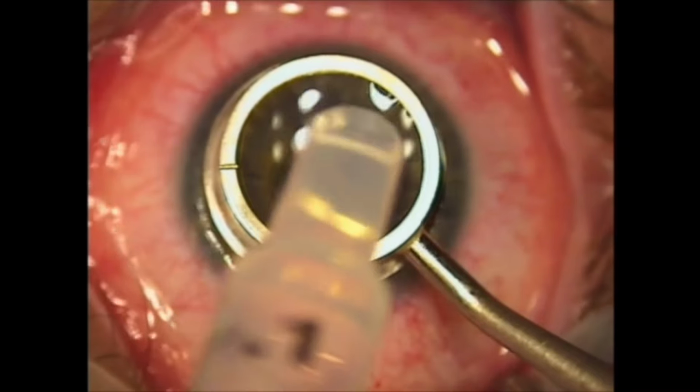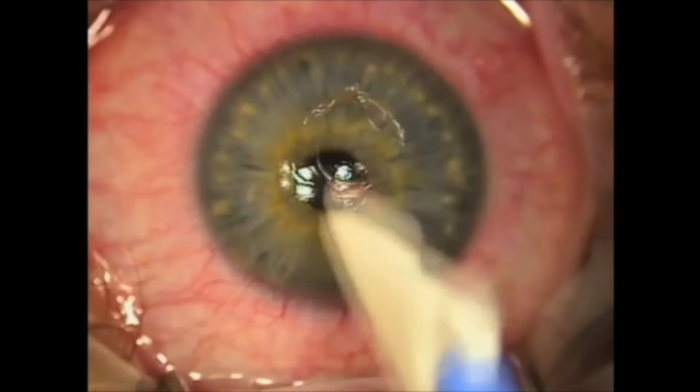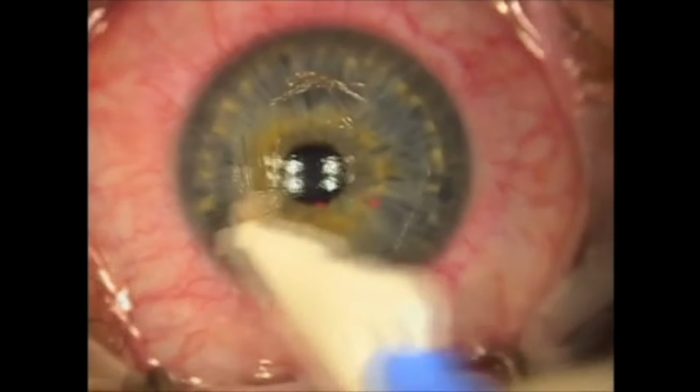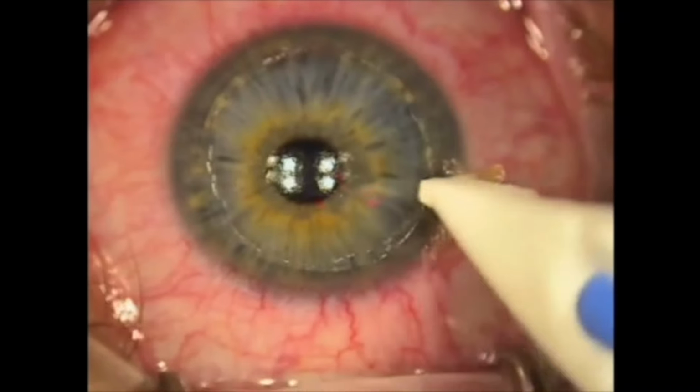This is Dr. George Waring from Charleston, South Carolina, and I'll be discussing photorefractive keratectomy, or PRK. Here you've seen we've applied a dilute alcohol solution which loosens the epithelium from the underlying Bowman layer, and in an atraumatic fashion, we can simply use a Weck-Cel to perform an epithelial rhexis, and you can see the sheen of the underlying Bowman layer.